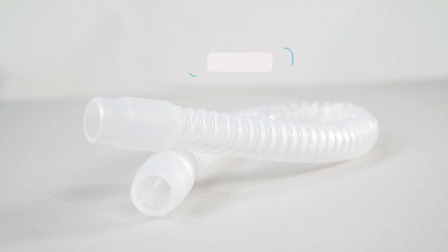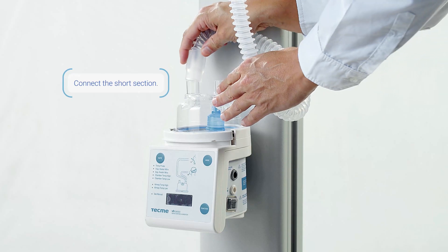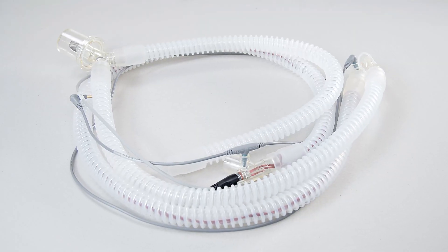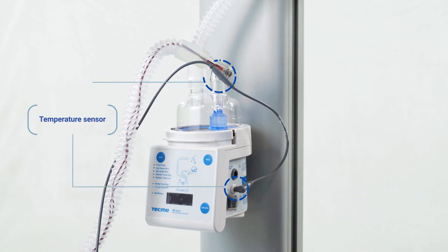Connect one end of the short section of the patient circuit to the patient outlet, and the other end to the inlet of the humidification chamber. Connect the inspiratory limb to the outlet of the humidifier chamber with the appropriate cables.